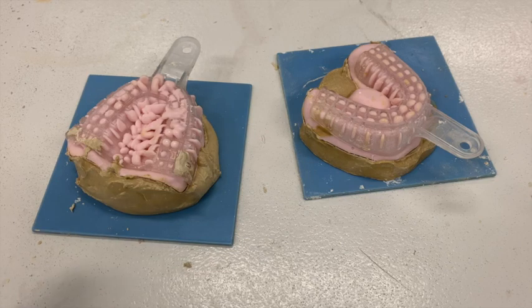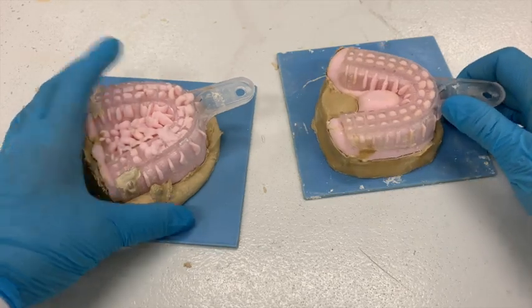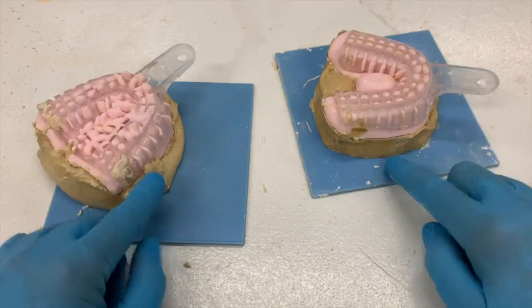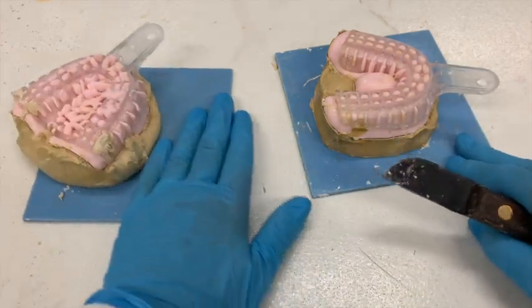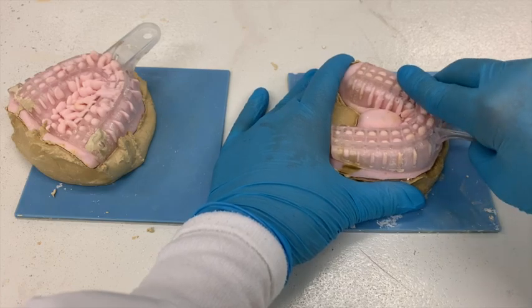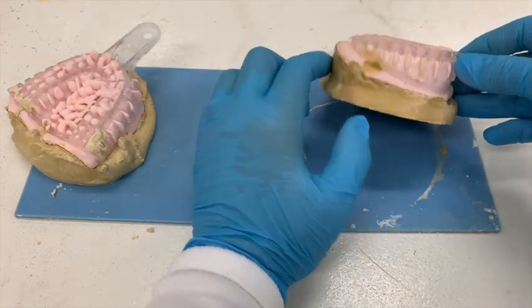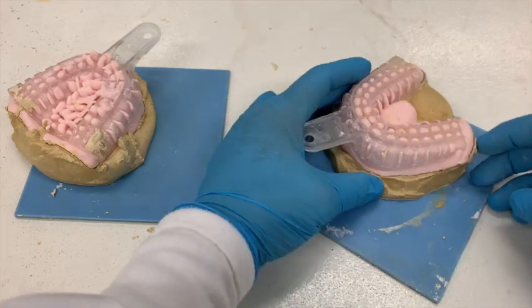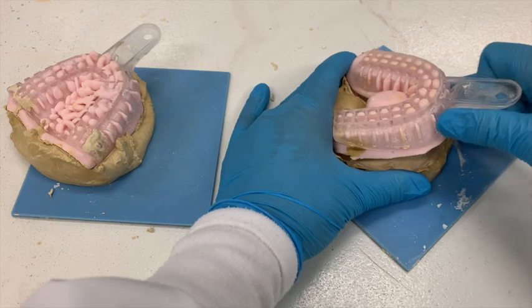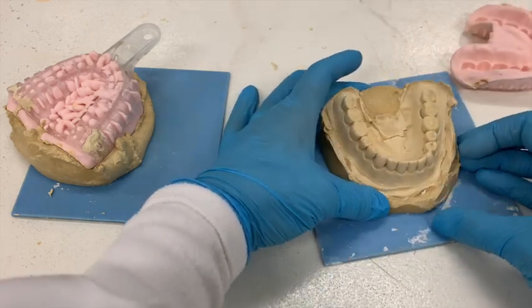It's been over an hour since I poured these up, so I'm going to separate and get rid of the impression on my model. I'm going to start with this one here. I always like to start by just trying it with my hand first. If you didn't get any gypsum that went up over the impression, it can be pretty easy to take off. I'll just hold on to the base and pull up — and that one came off extremely easy.